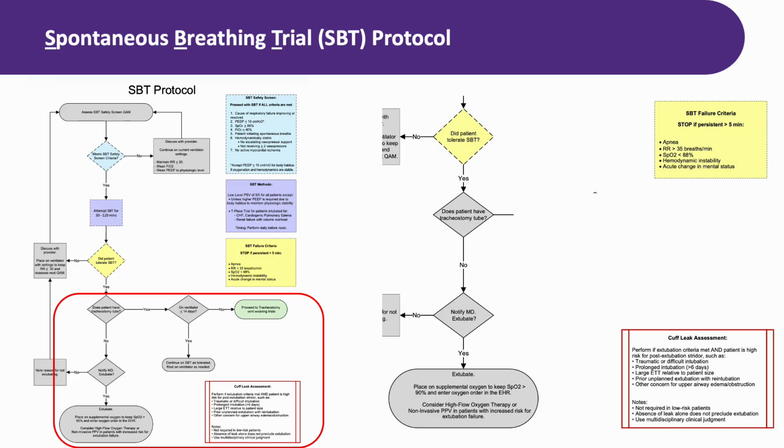In some cases, if the issue that caused the failure is resolved quickly, the provider may request an SBT the same day. That's fine, but it needs to be ordered. Remember, our goal is not to just perform SBTs. Our goal is to liberate patients from the ventilator as safely and efficiently as possible. Every failed SBT should trigger a problem-solving conversation, not just a notation in the chart.